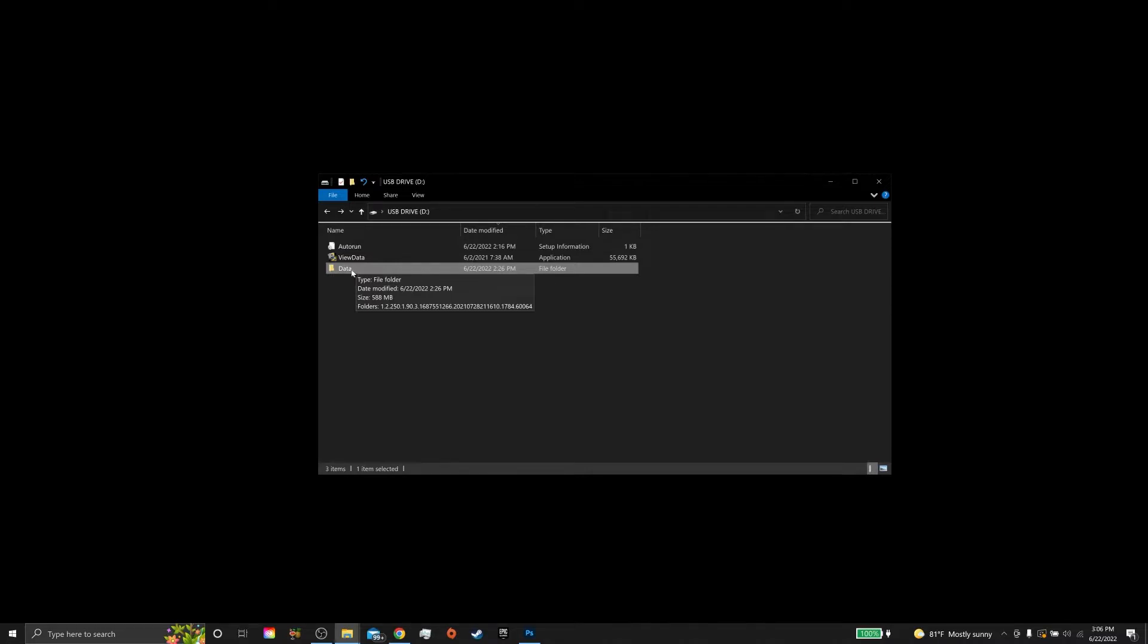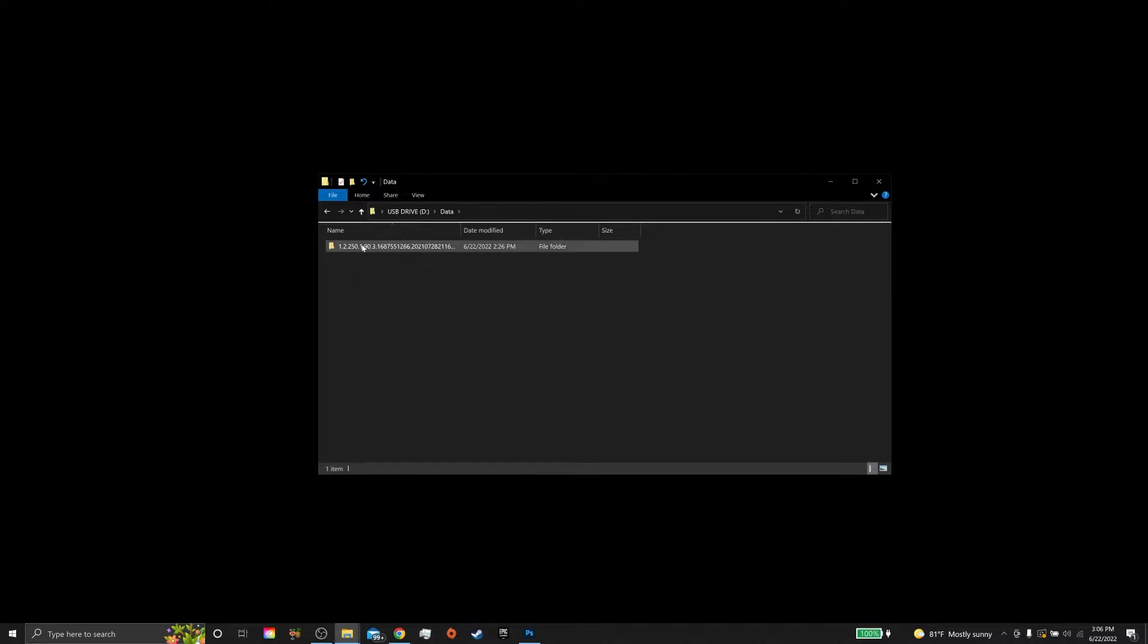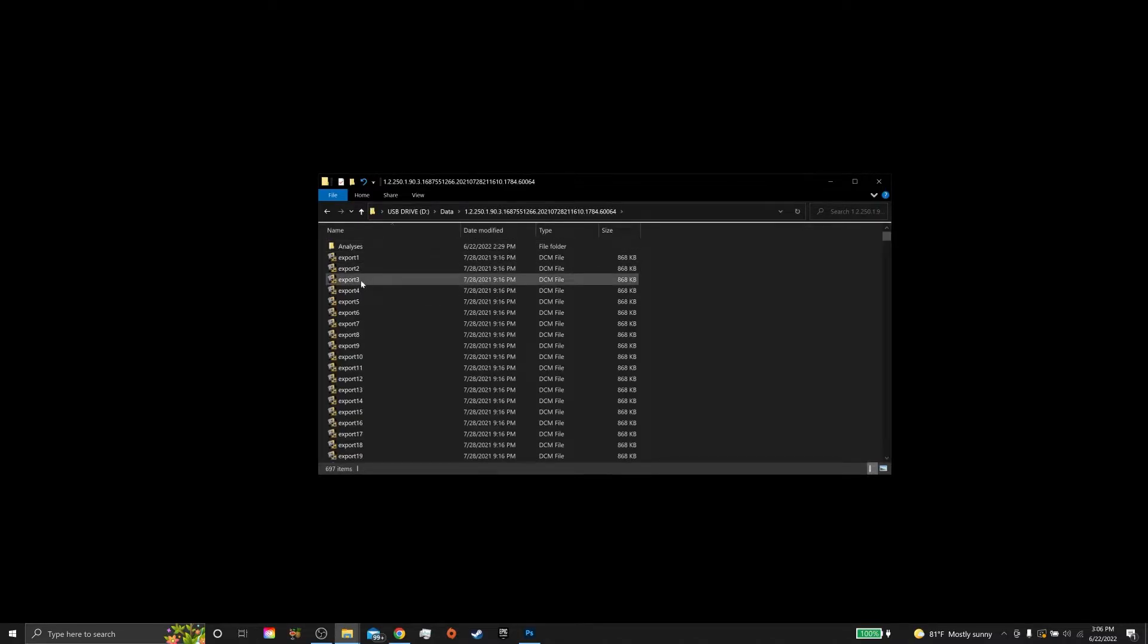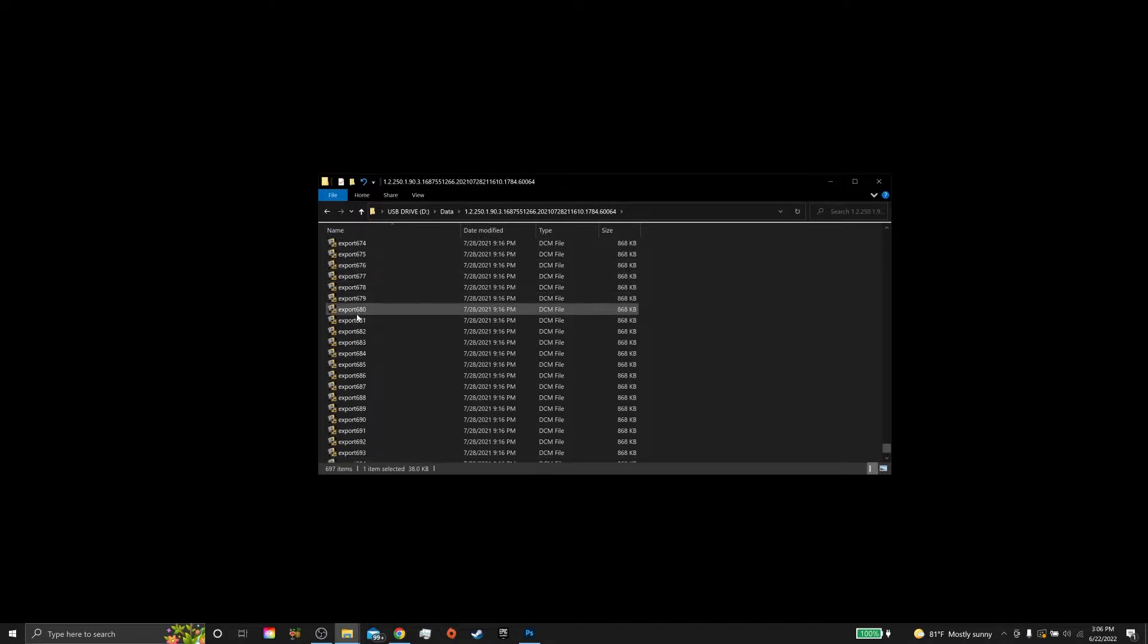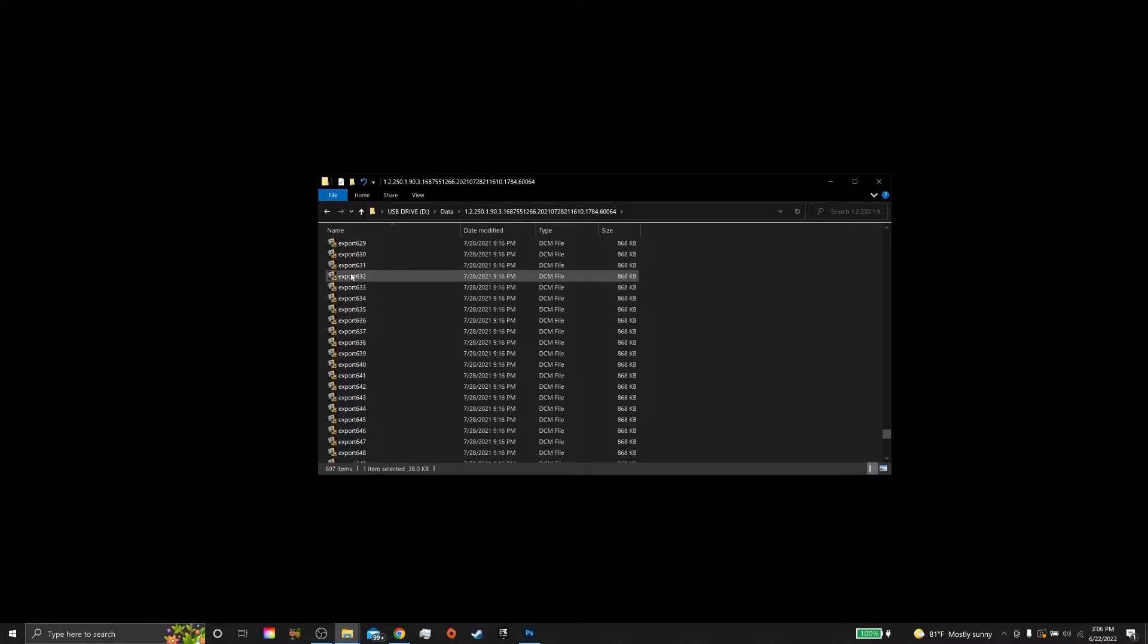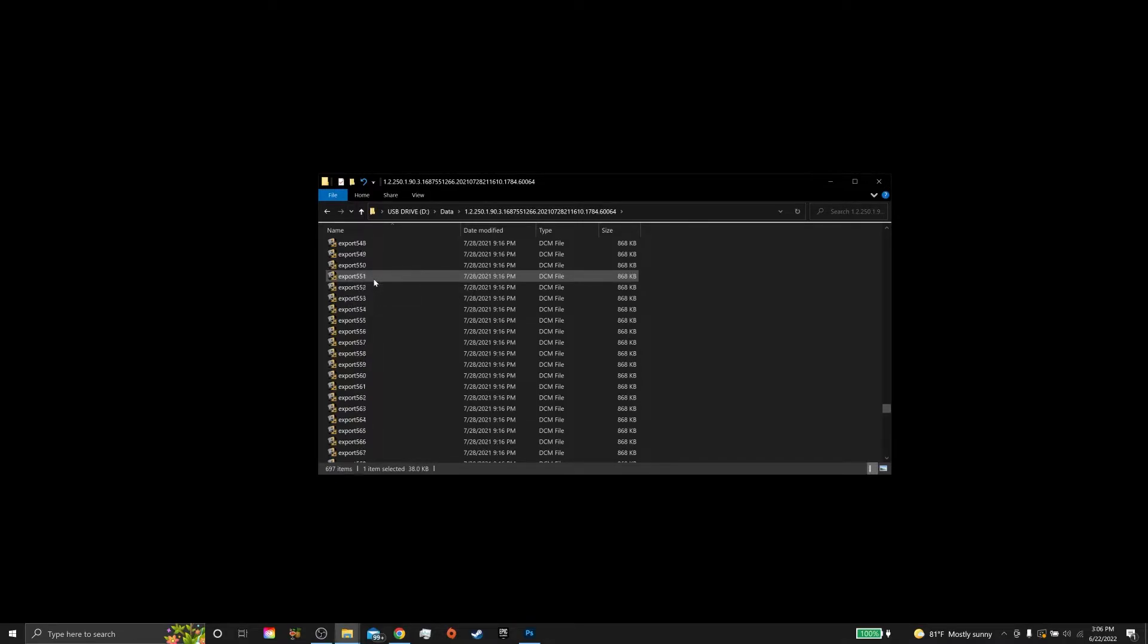That can be accessed through this data folder. If I double-click that, it takes us to the folder with the DICOM file in it. This is a file per slice DICOM. We just generally have to open one of these up into your 3D viewing software, the one you already have in your clinic, and that should launch right in there. Otherwise, you can click on Open With and find the file that way too.